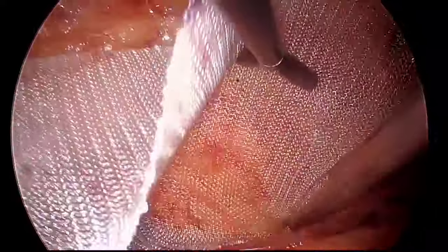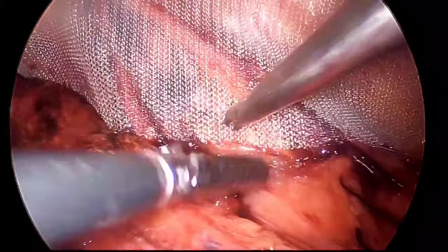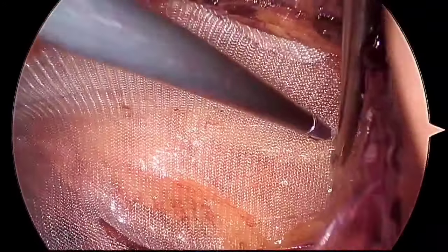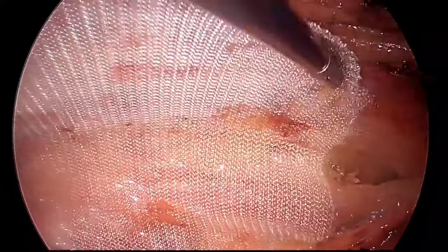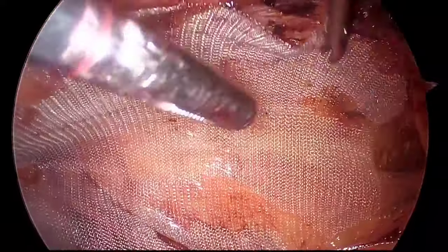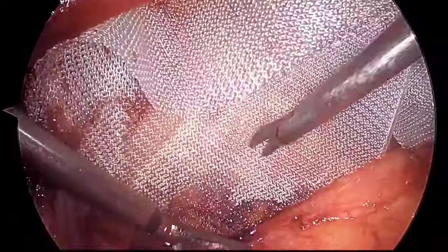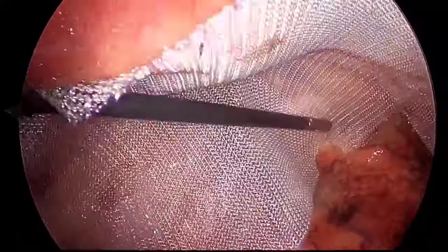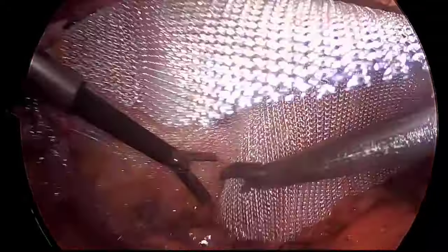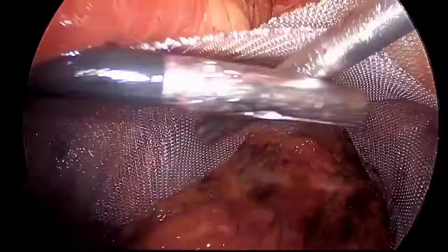Now you can see the lower outer corner of the mesh, placing it nicely without any folding is very important. So you can see all the surrounding margins of the mesh should be lying flat, and there should not be any undue folding of the mesh, nicely sitting. Also the left mesh, 12 by 15 centimeter regular that I use for groin hernias, was placed. There is a 12 by 15 centimeter medium weight polypropylene mesh, and that is also sitting nicely.